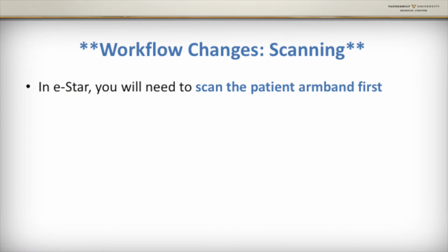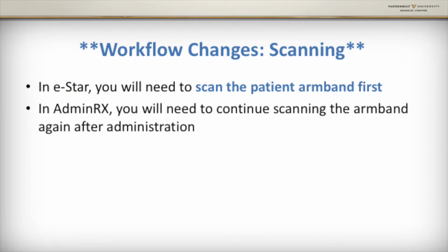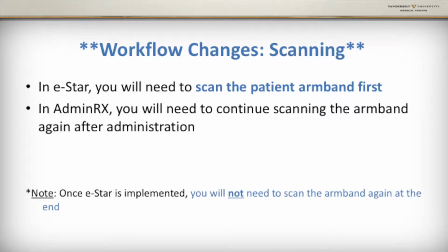In eStar, you will need to scan the patient's armband first. While using AdminRx, you will need to continue scanning the armband again after administration. But once eStar is implemented, you will not need to scan the armband again at the end.